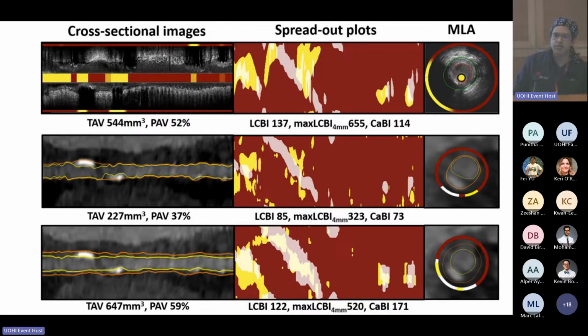So the studies that show that there is incremental value for plaque characterization over just whether they've got stenosis or not, for predicting major adverse events, is that on top of plaque burden? Yes. It's on top of plaque burden, above plaque burden. Yes. So quantitative plaque burden.